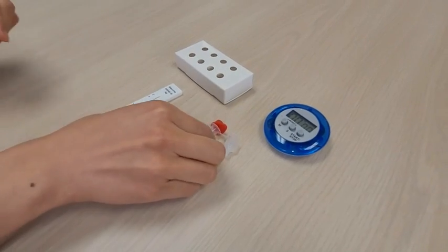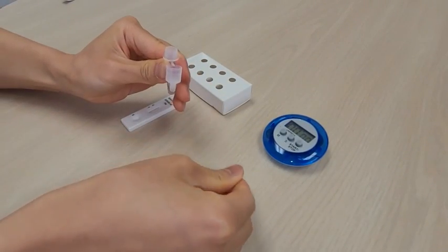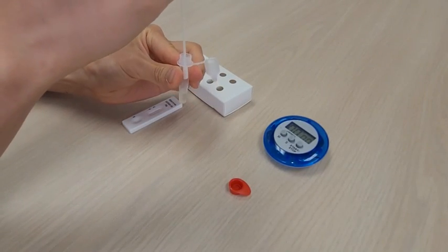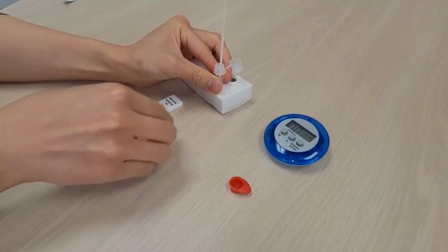Open the cap on the extraction buffer tube by pushing the cap handle upwards while firmly holding the tube. Place the extraction buffer tube into the workstation. Alternatively, you can hold the extraction buffer tube by hand.